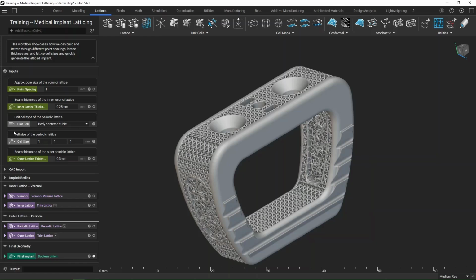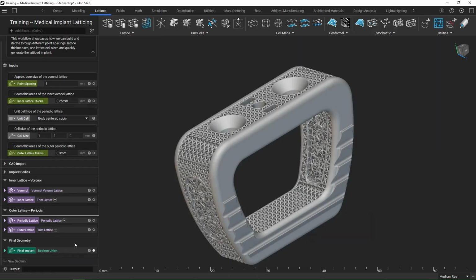So these are our 5 inputs that we're playing around with. Of course, we have to tell nTop what it is we want to output from there, right? Because we've got all of these different blocks, different steps along the way. Could be really anything. But in this case, my final geometry, my final implant, that's what I want to output from my custom block. So I'm going to go ahead, just drag and drop this into the output right there.